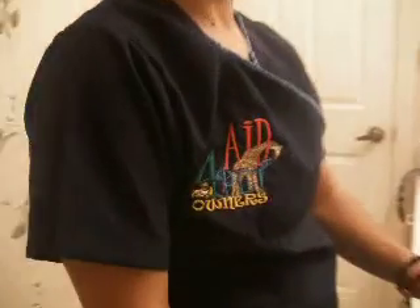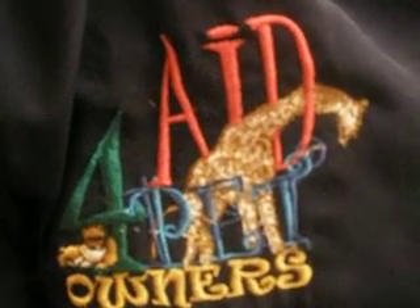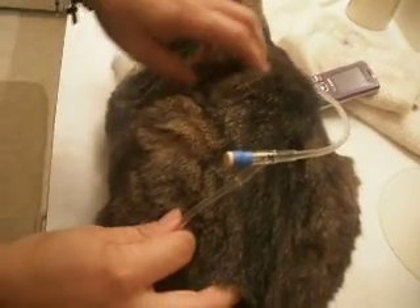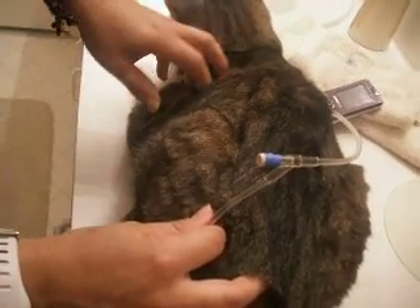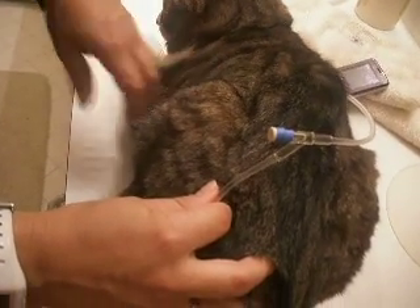When you give fluids to your cat or dog, don't be afraid that there's going to be a little bubble afterwards — it's normal. The bubble will be absorbed by the body and distributed to where it needs to go. By tomorrow there won't be any bubble under the kitty's skin.